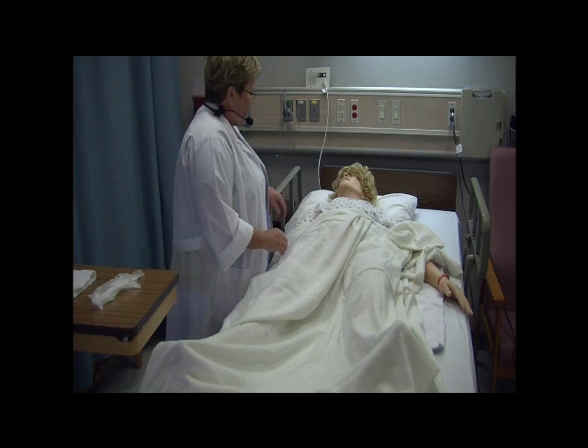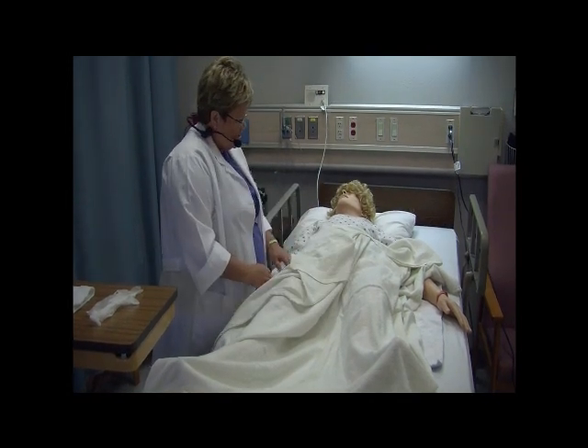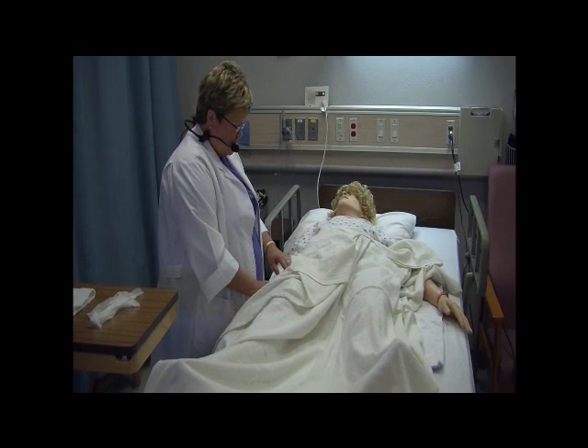Ms. Green, my name is Stephanie Guy. I'm your nurse today. The doctor's written some orders for you. Before we get started, will you state your name and date of birth, please?